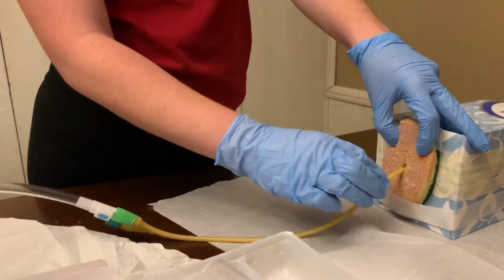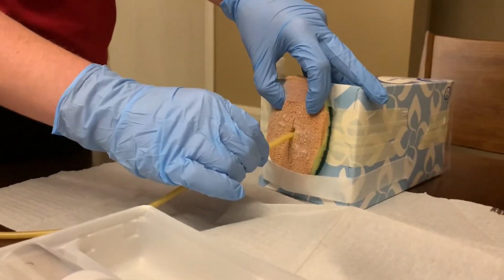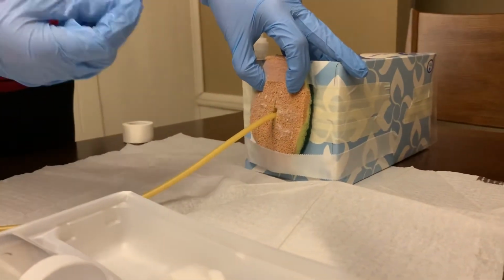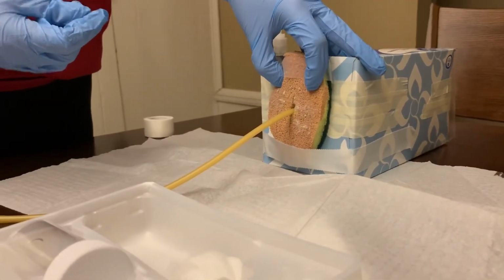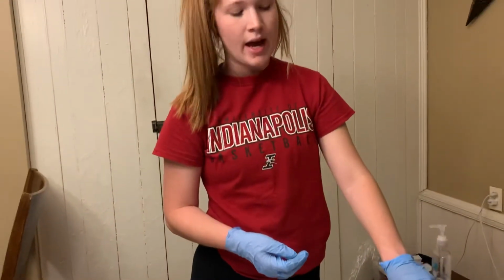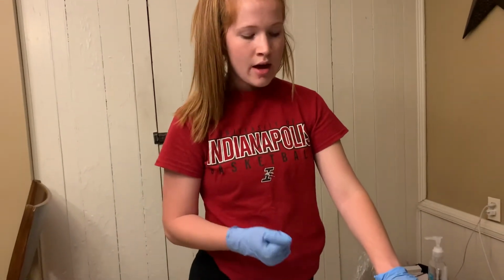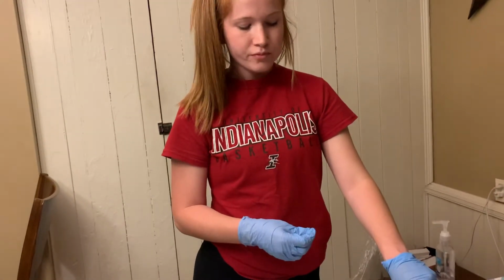To check the placement, I'm going to just give a little tug on my catheter. That tells me that the balloon is inflated and it is in place. If my patient complained of any pain during this or after that was placed, I would withdraw the solution, advance the catheter, and then try to inflate the balloon again.